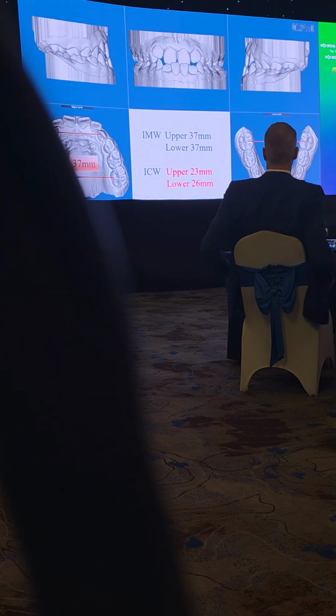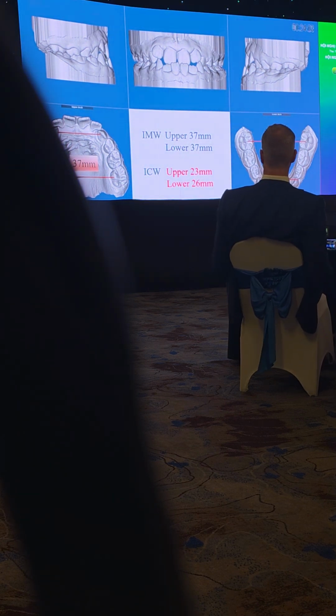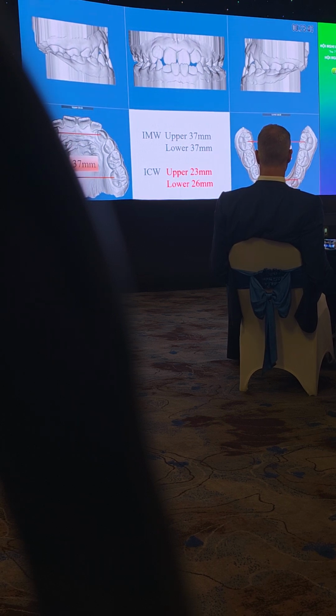Also, if you do an intraoral scan, then you can check if the width in the anterior and the posterior match or not. That means intermolar and intercanine. You gotta check both, because sometimes intercanine width is narrow, sometimes intermolar width is narrow. So this particular patient, intermolar is okay, but intercanine is a little bit deficient. That's why there is crowding on the upper arch.